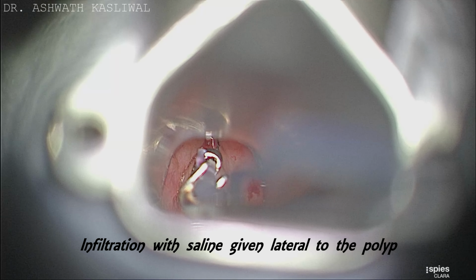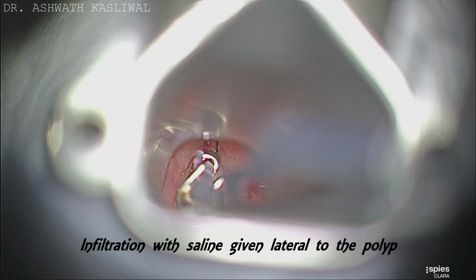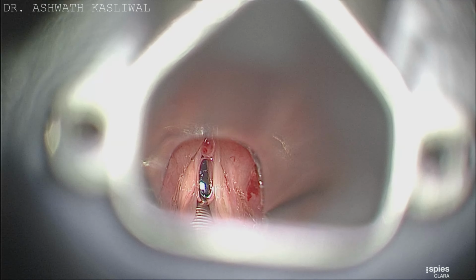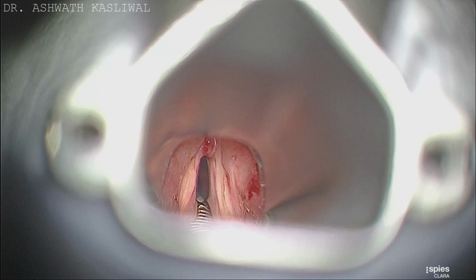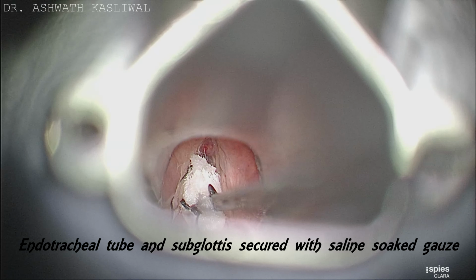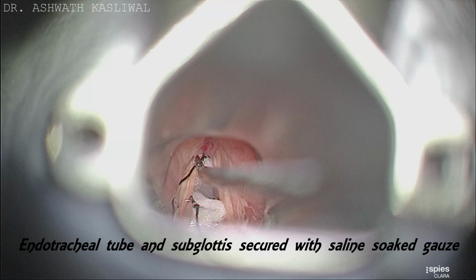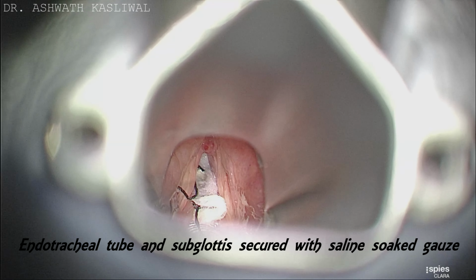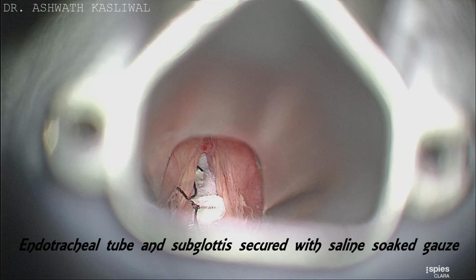To begin with, we have to infiltrate the polyp with saline. This basically helps in the dissection of the polyp with the laser. While using the laser, it is important to secure the endotracheal tube and the subglottis with gauze, as the laser beam might damage the important structures.